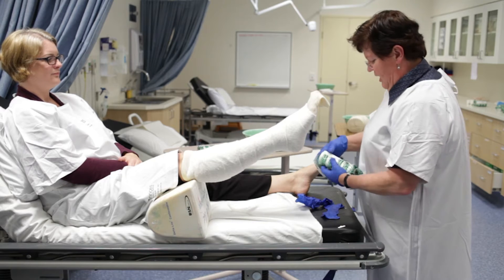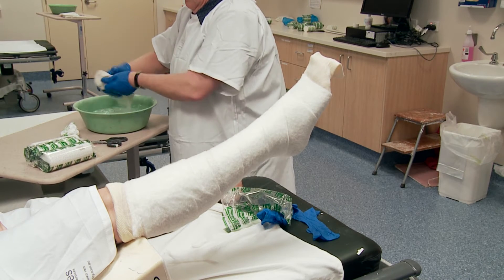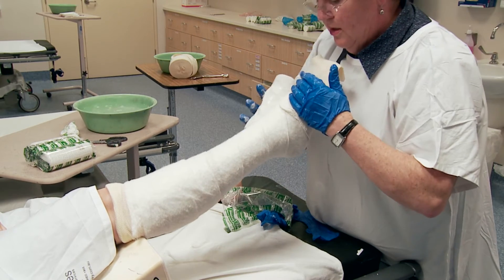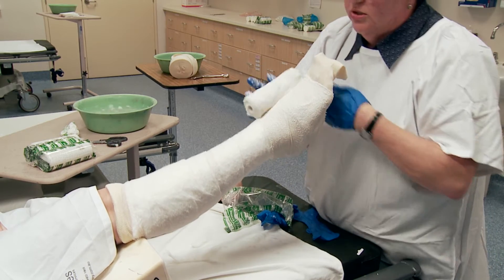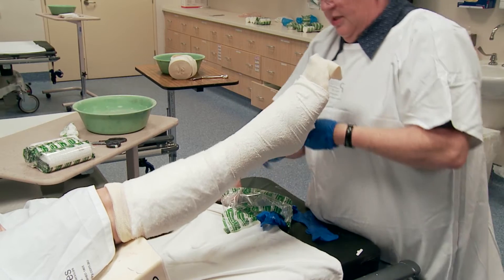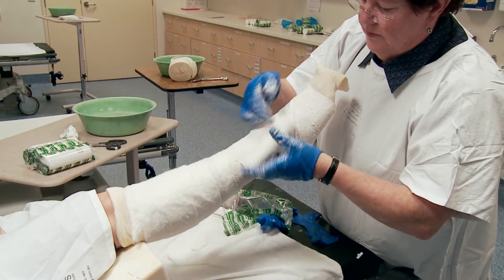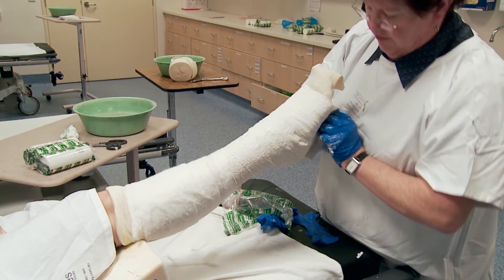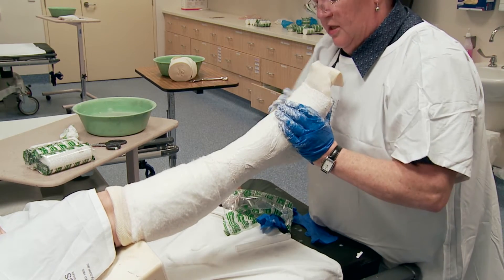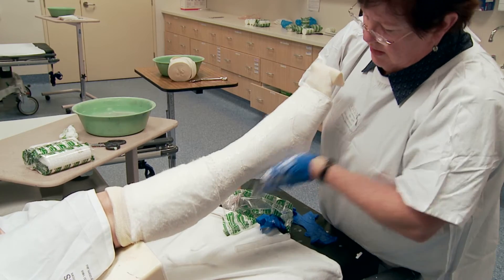You start off at the toe end and use the first roll — it's just at the fracture side. Start at the bottom, just covering the soft band. It's an up-and-drop motion — never pull it. The first roll is always at the fracture side, so you concentrate around the foot, the heel, and the ankle. Never go above the soft band because then it will be too hard and you can't see your toes. Just caress the plaster, moulding it towards the skin.